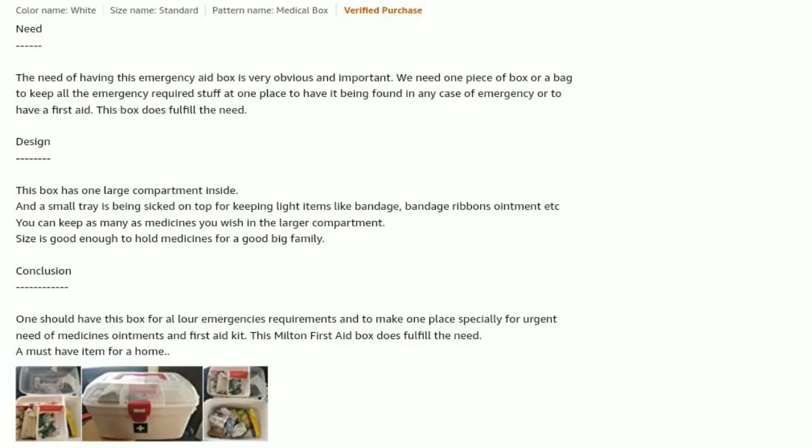The need for an emergency aid box is very obvious and important. We need one box or bag to keep all emergency-required items in one place, so they can be found easily in any emergency or first aid situation. The box does fulfill that need. Design-wise, the box has one large compartment inside, and a small tray on top for keeping light items like bandages, bandage ribbons, etc.